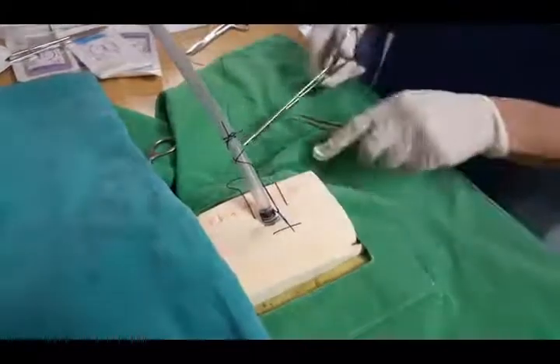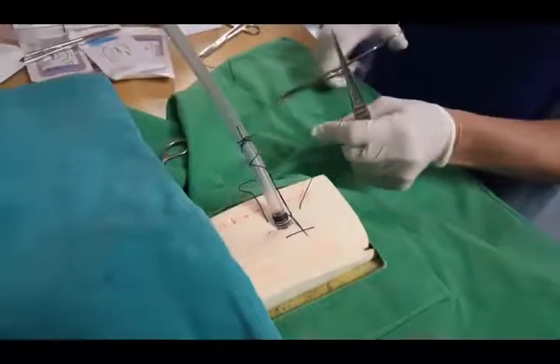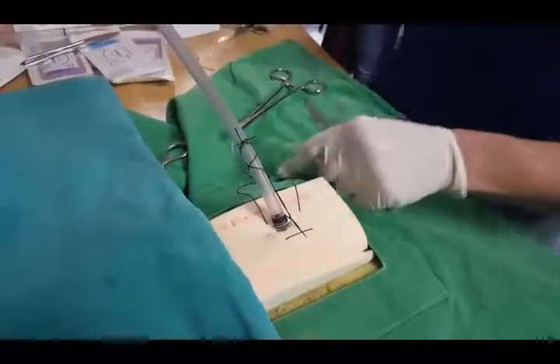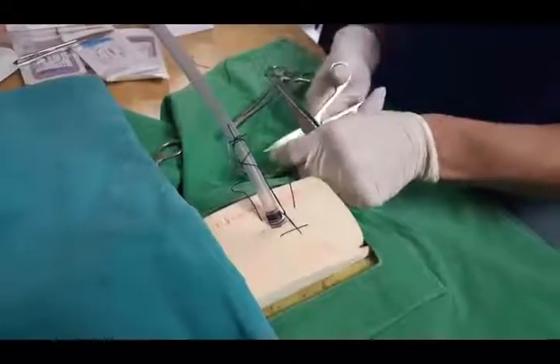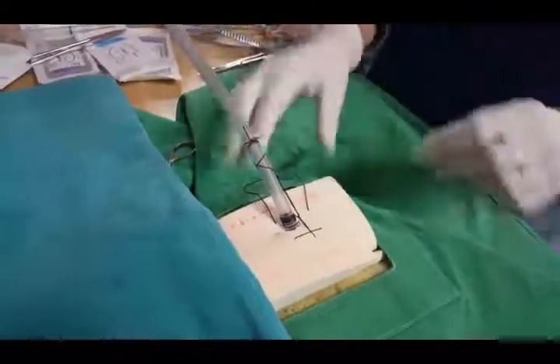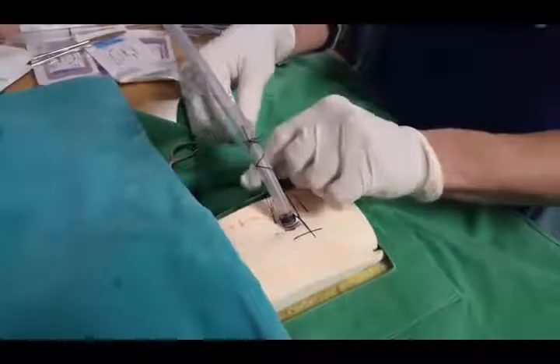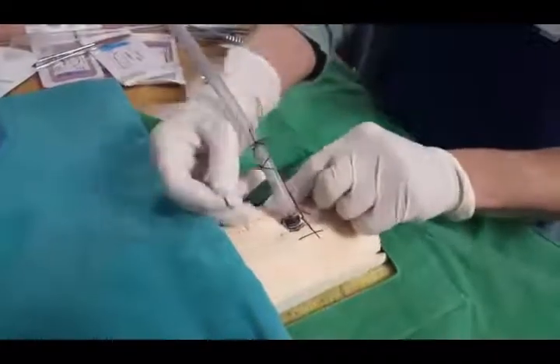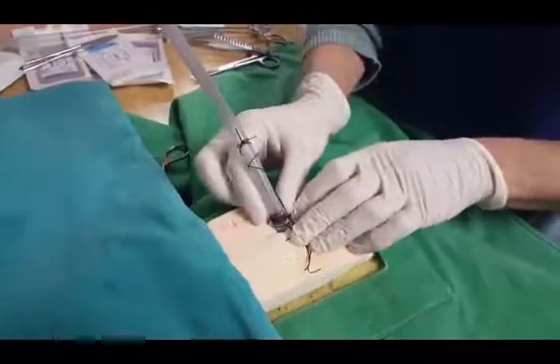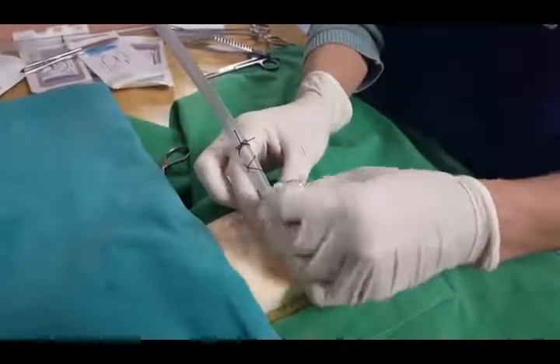Basically at this point you cut off the tails. It's much better obviously if you've got longer tails because it leaves you more to work with, but this will do the trick. This would basically just be put under the dressing when you dress around the wound, around the incision and the tube.